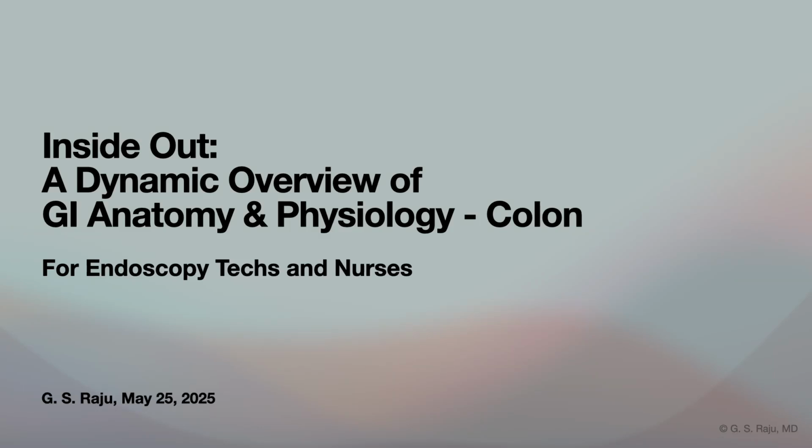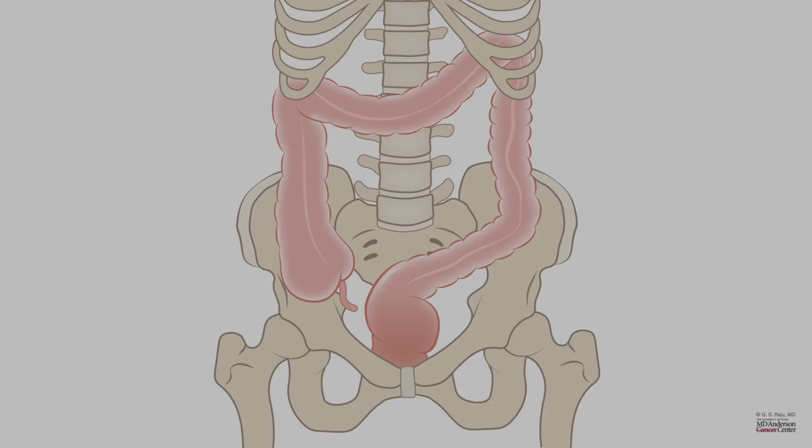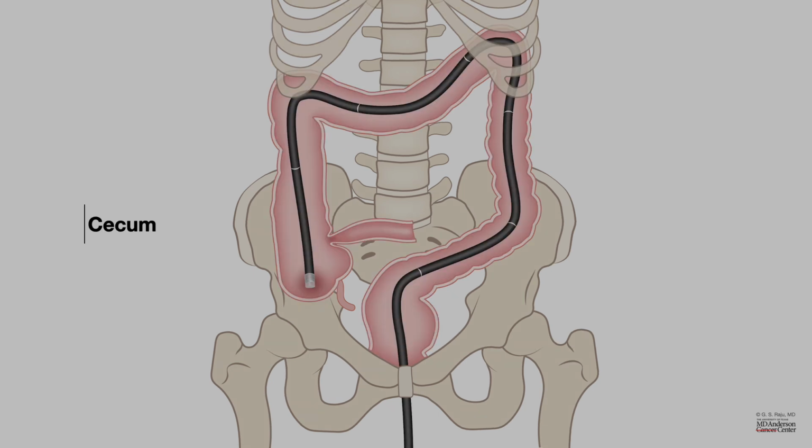Greetings. Let me review colon anatomy and pathology relevant for endoscopy nurses and technicians. One of the commonest procedures that we perform is screening and surveillance colonoscopy. In this, the goal is to reach the cecum in over 95% of the cases.